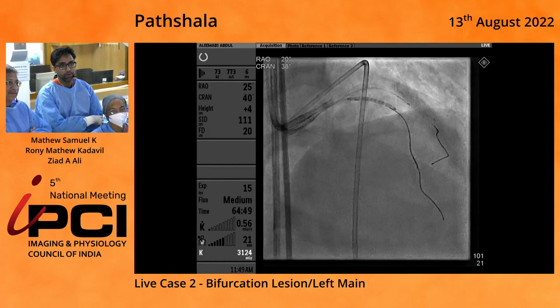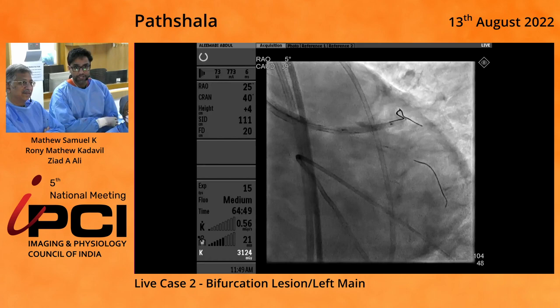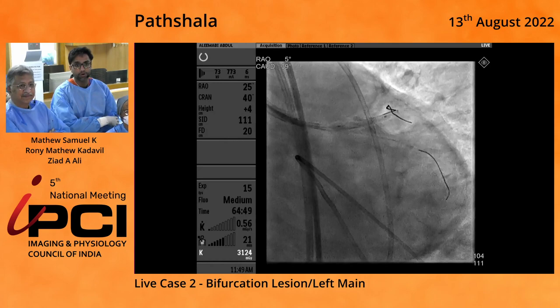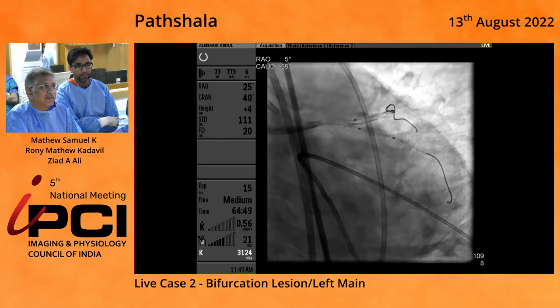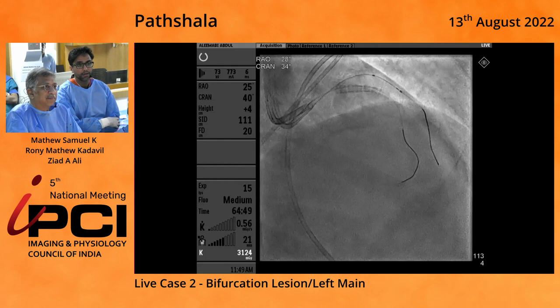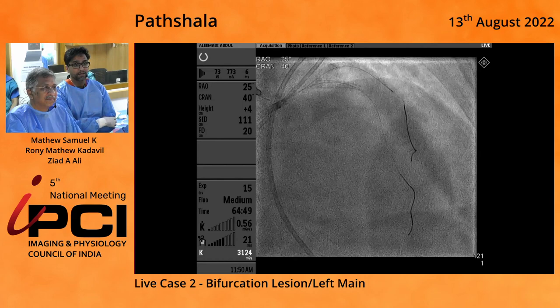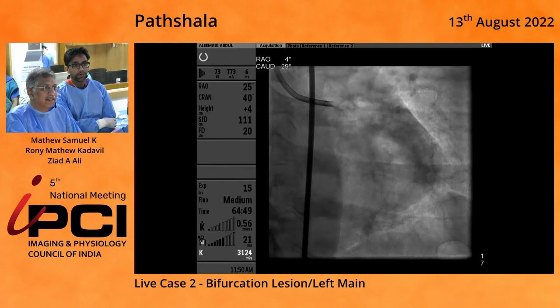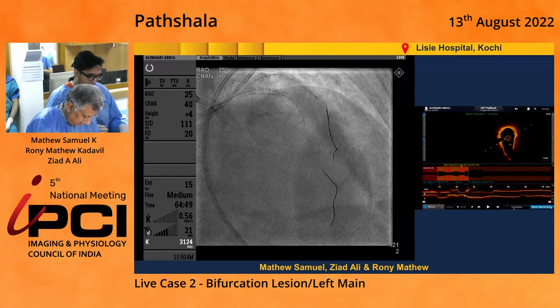We use device detection to deploy our Graftmaster. This is a 2.8 Graftmaster by 19. We actually used our 7 French guide and had a 2.5 compliant balloon in the circumflex in order to snorkel in case we shut the circumflex down. You can see there's the circumflex balloon. We then finished by doing a kissing balloon inflation. That's post-dilating the stent graft. We post-dilated with a 3.0 NC at 20 atmospheres. Now we're going to do a final OCT to show you how many Graftmaster struts are in the left main.